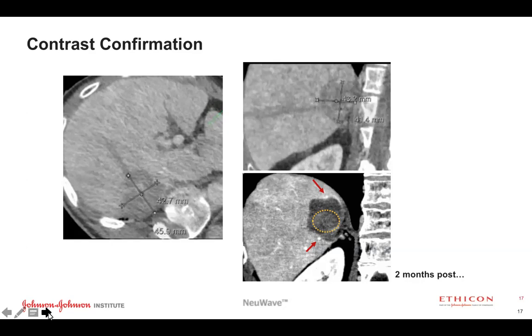You could see how, especially towards the more peripheral aspects of the ablation, where the energy may not be depositing quite as rapidly, that heat sink can be a little more influential. So something to consider when you're planning your ablation. If you have big vessels close by, you may want to sheath a couple of the antennas a little bit closer to that margin just to ensure that you're able to achieve that 5 to 10 millimeter margin goal that we discussed earlier.